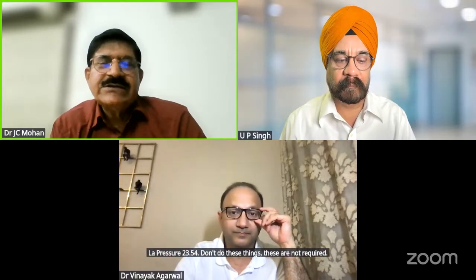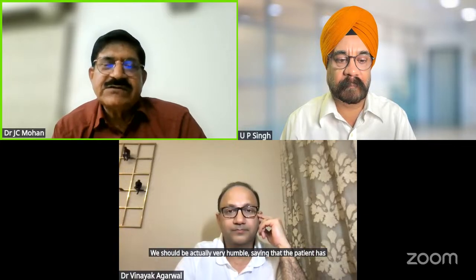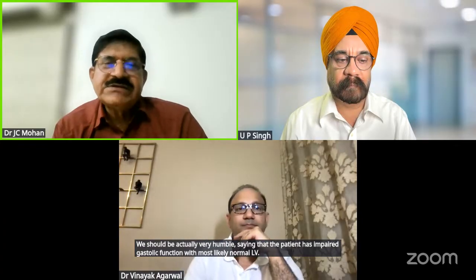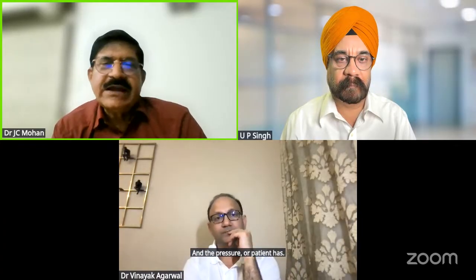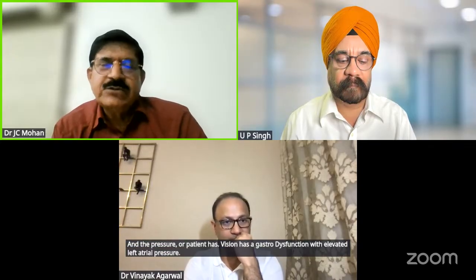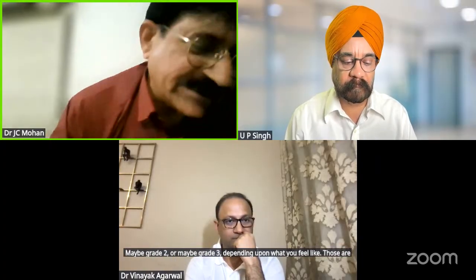Don't do these things. These are not required. We should be actually very humble, saying that the patient has impaired diastolic function with most likely normal LA pressure, or the patient has diastolic dysfunction with elevated left atrial pressure, maybe grade 2 or maybe grade 3, depending upon what you feel. Those are my words about this.